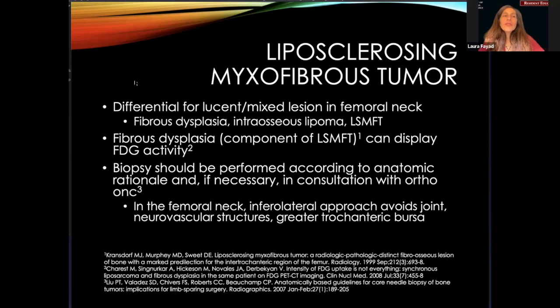So I don't see any questions in the chat, but I'll give a quick comment here. What could help with the diagnosis of this entity is, if you had an MRI or a CT scan, which you did here, to look at the soft tissue windows and see if you can make out some lipid content, because this lesion has fibrous, lipomatous, and cystic content. If you can make out some lipomatous content, that would help you arrive at this diagnosis quite comfortably. So something else to think about.